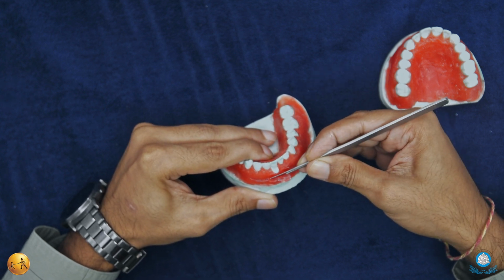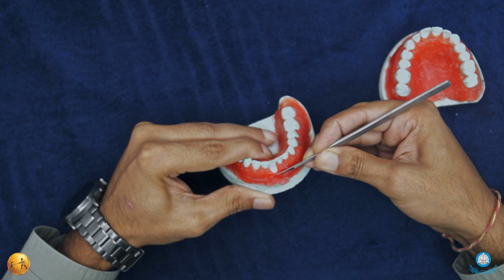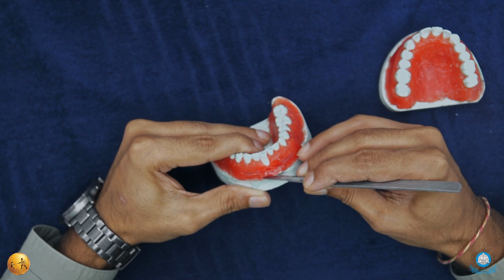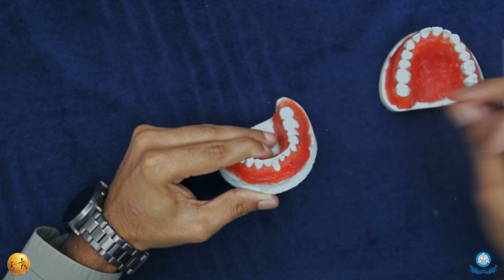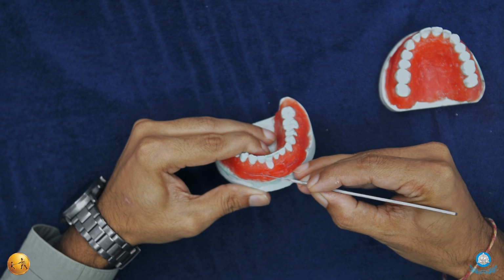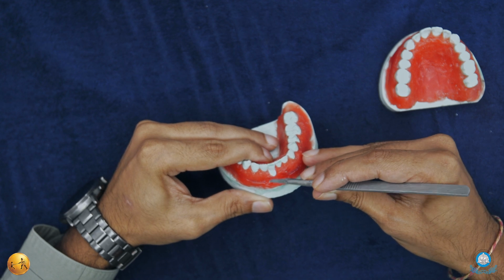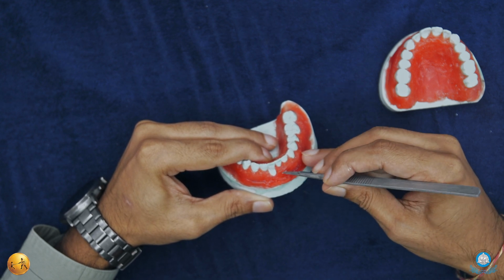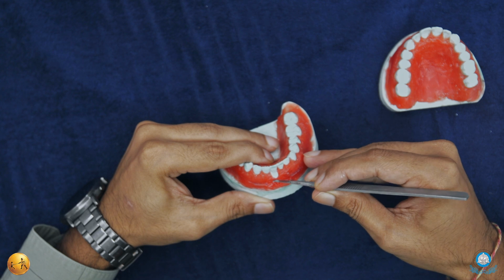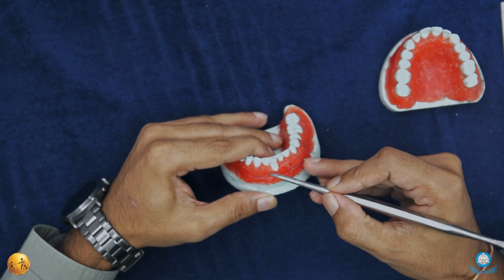So once the horizontal and vertical incisions are given, we will be removing the portion of epithelium and some portion of connective tissue. So that leaves periosteum and a portion of connective tissue remaining on the recipient site. This is the area which will receive the free gingival graft. So the whole purpose is to increase the width of attached gingiva apical to the recession. Our target here is not to achieve root coverage, but to increase the width of attached gingiva. So this is the recipient site preparation.